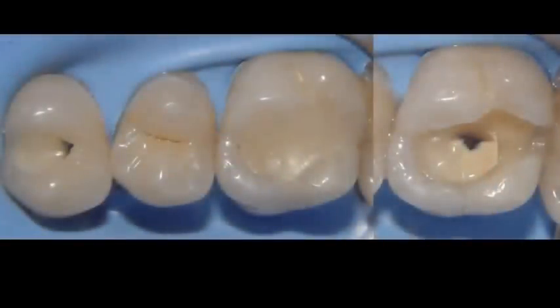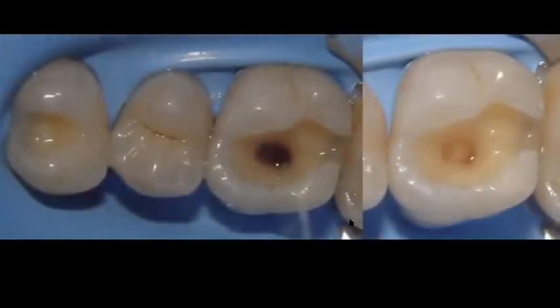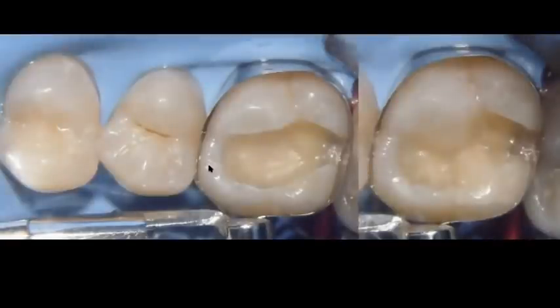We have a visual picture in our mind every time we're restoring teeth, and we're thinking about occlusal anatomy that we all know very, very well. And again, this is now a maxillary first molar, and you can see a little bit of deep caries dentin there. We're going to go ahead and remove that, and then we're going to place a liner. We're going to use Vitrebond again.